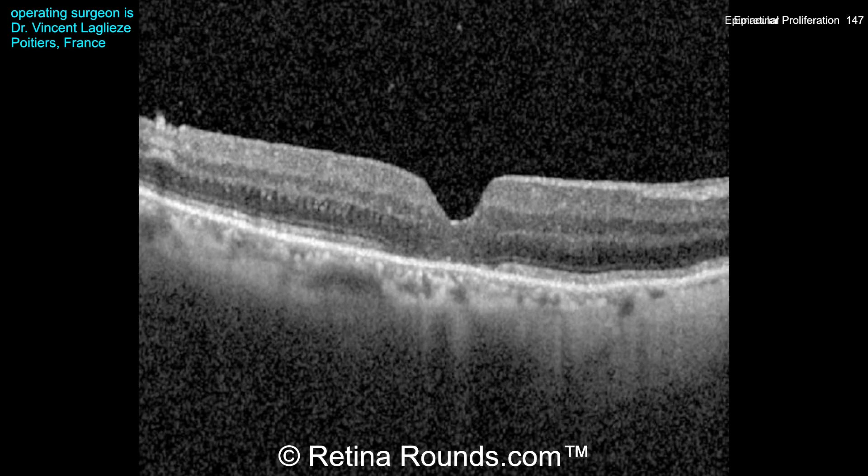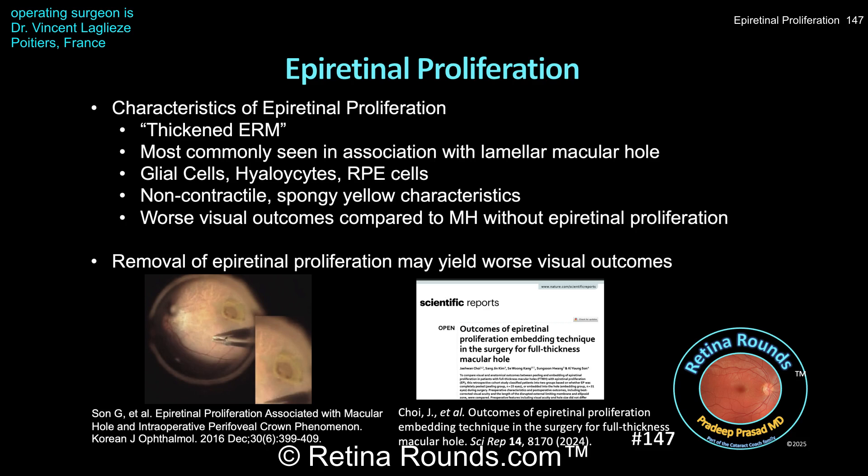That attenuation may limit the patient's postoperative visual outcome, but this is not an uncommon finding in patients who have epiretinal proliferation. Epiretinal proliferation was initially described as a thickened ERM, but it is different from a traditional ERM in many respects. On OCT, it appears thicker with medium reflectivity and is continuous with the underlying ILM, whereas ERMs tend to be hyper-reflective on OCT, thinner, and may be associated with retinal striae, suggesting a contractile property. There can be associated gaps between the ERM and the underlying ILM.